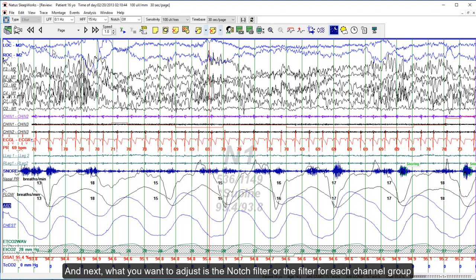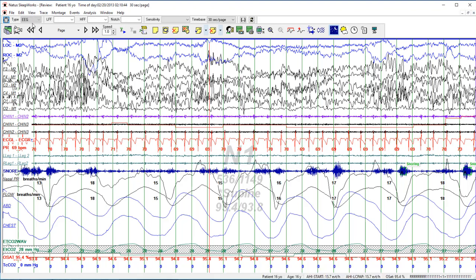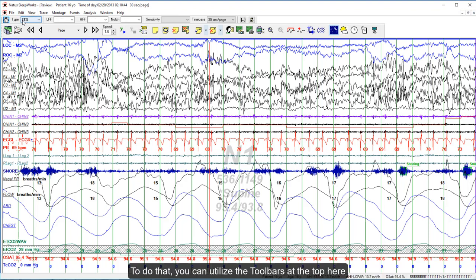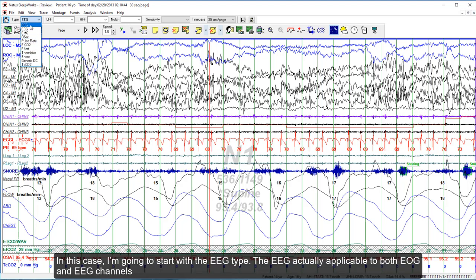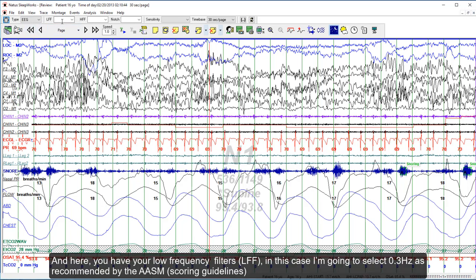Next, you want to adjust the notch filters or the filters for each channel group. To do that, you can use the toolbar at the top. Select the channel type from the drop-down list. In this case, I'm going to start with the EEG type, which is applicable to both EOG and EEG channels. Here you have your low frequency filters — I'm going to select 0.3 Hertz, as recommended by the AASM.